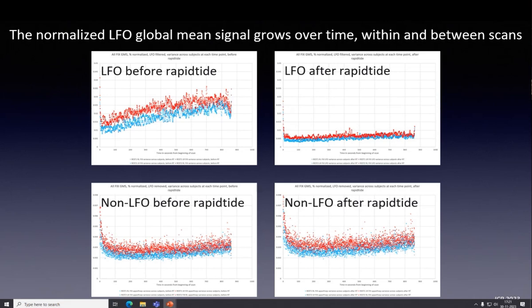One thing we did find is that people probably don't throw out nearly enough time points at the beginning of the scan. I look at that and I say you should throw out the first 100 time points. But that's interesting. T1 decay seems to last a lot longer than you would think it does.